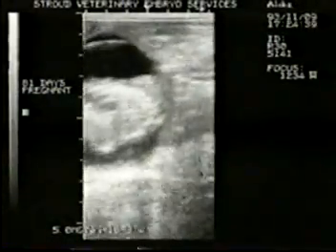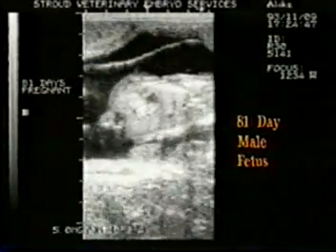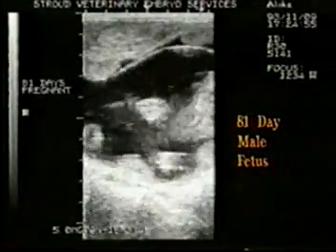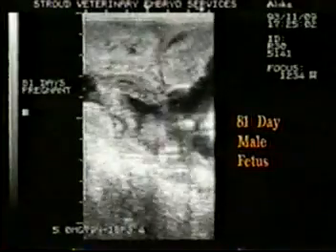Compare the size of the 81-day to the previous 75-day fetus. It is important to understand how quickly the fetus grows from one week to the next. It sometimes is difficult to get proper orientation after 85 days of pregnancy due to the relative size of the fetus. The umbilical cord is a valuable aid in helping to locate the male GT.